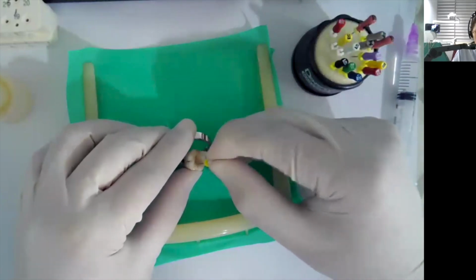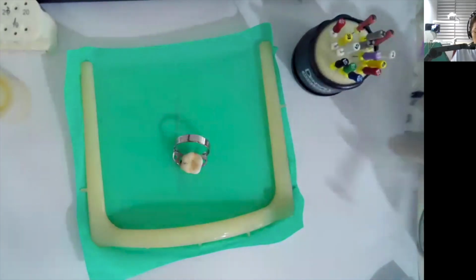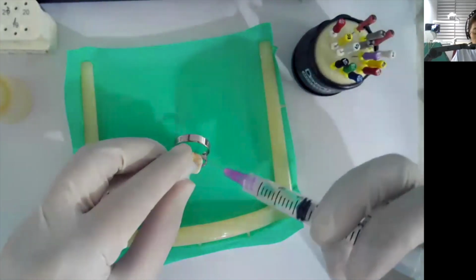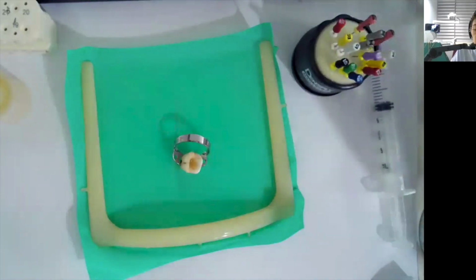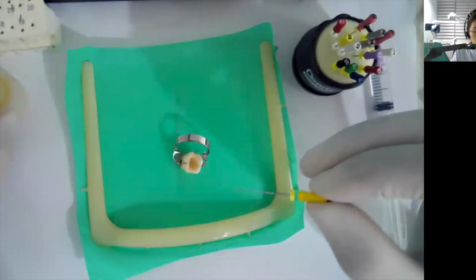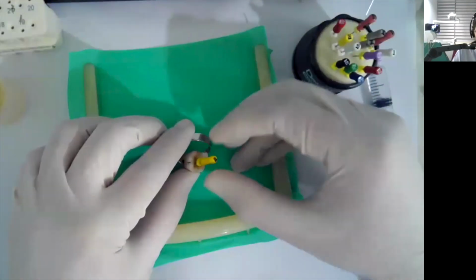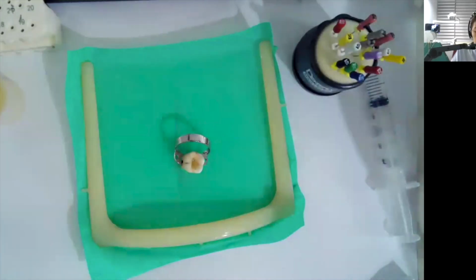Know that there's a curvature on this tooth. Then it's time for me to irrigate again. And then I'll move to size 20, measure at 22.5, put some EDTA. Always make sure that you reach the working length, and then irrigate again.